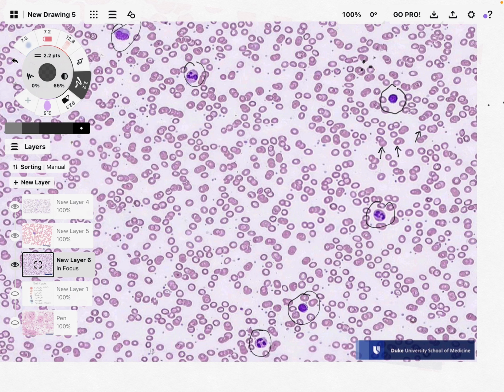Neutrophils are, again, the most common. Roughly 70% of the white blood cells you're looking at are neutrophils. Neutrophils have a granule texture because they are granulocytes. But it is worth noting, unlike eosinophils and basophils, those granules don't stain as dark or as thick. If you're trying to distinguish a neutrophil from, for example, an eosinophil, which would be the thing that looks closest to a neutrophil, the granules of neutrophils are smaller and tend to not stain as thick and as dark as an eosinophil.